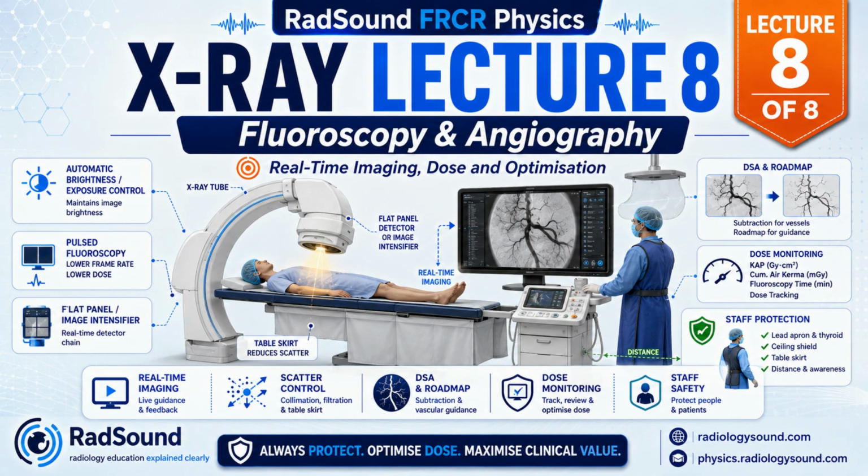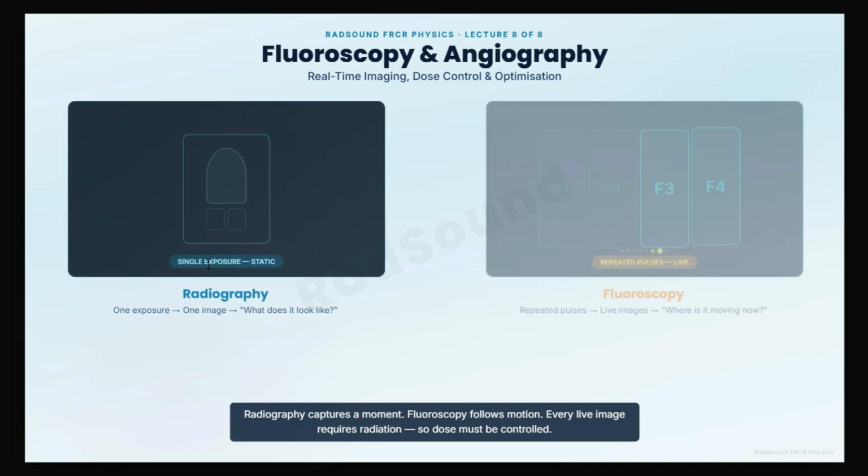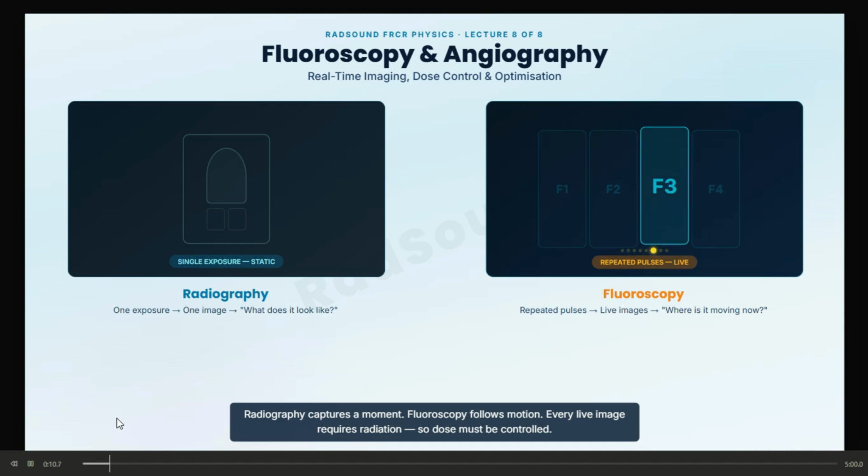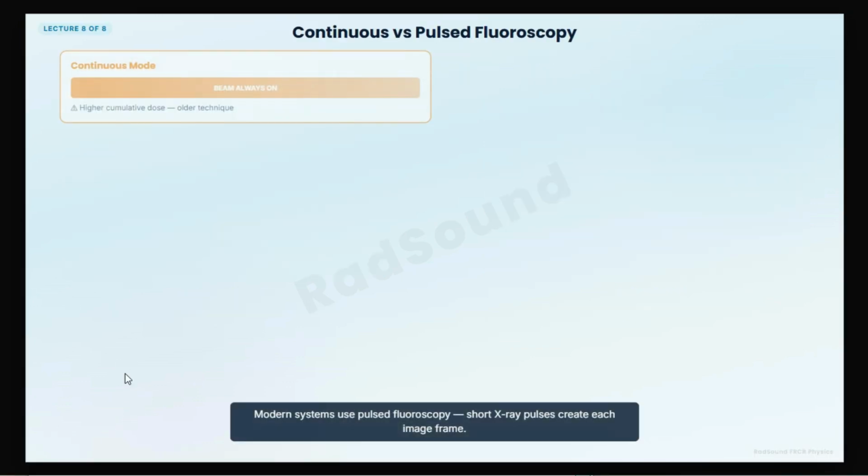You have spent a lot, you have dedicated a lot because you made it. Radiography captures a single moment. So let's compare both of them. If radiography captures a single moment, what about continuous fluoroscopy?